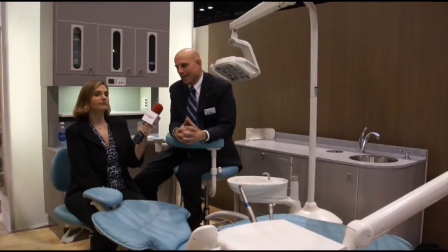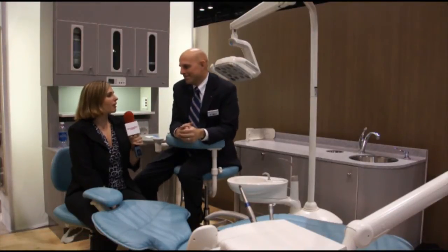Today, we're happy to introduce the ADEC LED light. And can you show us how it works?